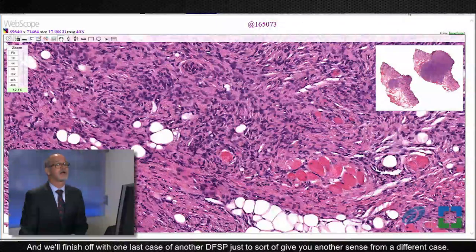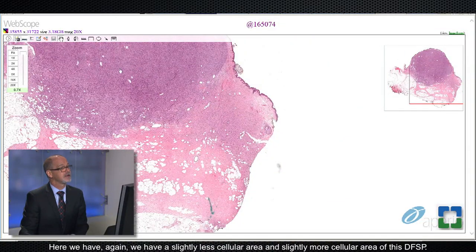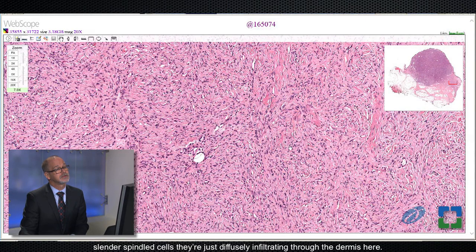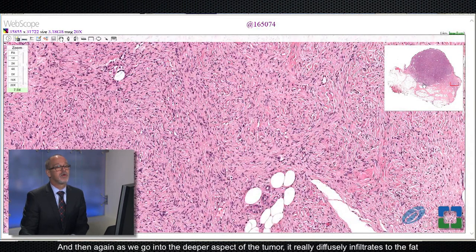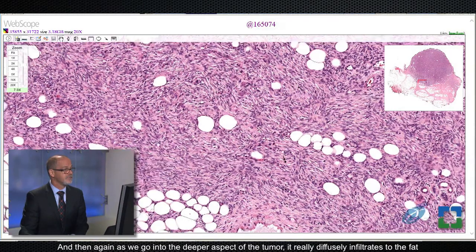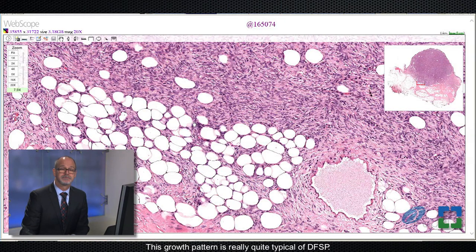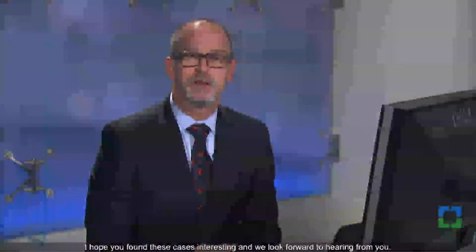We'll finish with one last case of DFSP. Here we have a slightly less cellular area and a slightly more cellular area. Even in the less cellular area, these very uniform, hyperchromatic, slender spindled cells are just diffusely infiltrating through the dermis — not encircling and entrapping the preexisting collagen bundles like we saw in cellular fibrous histiocytoma. As we go into the deeper aspect of the tumor, it really diffusely infiltrates through the fat and percolates through and around the adipocytes. This growth pattern is quite typical of DFSP. If you recognize that, you have a good clue to make this diagnosis. Thank you for your attention — I hope you found these cases interesting and we look forward to hearing from you.